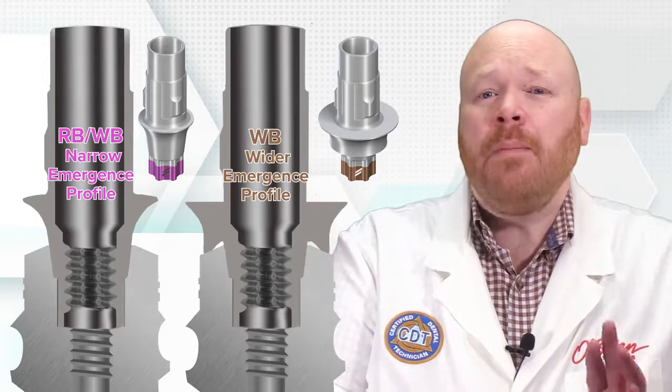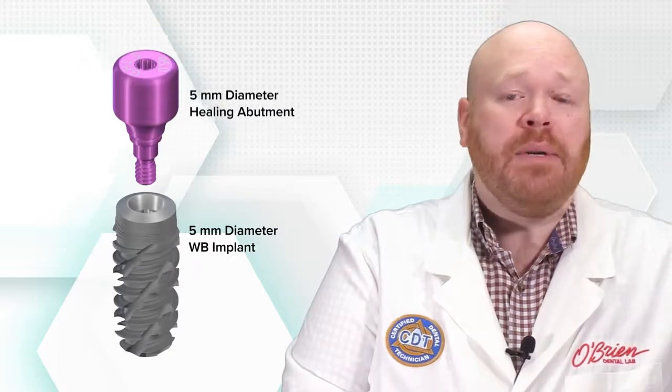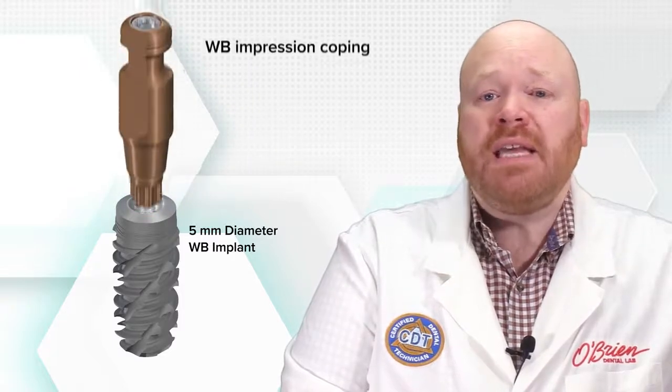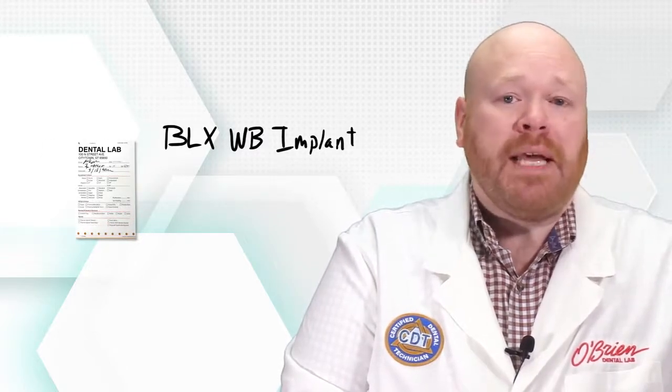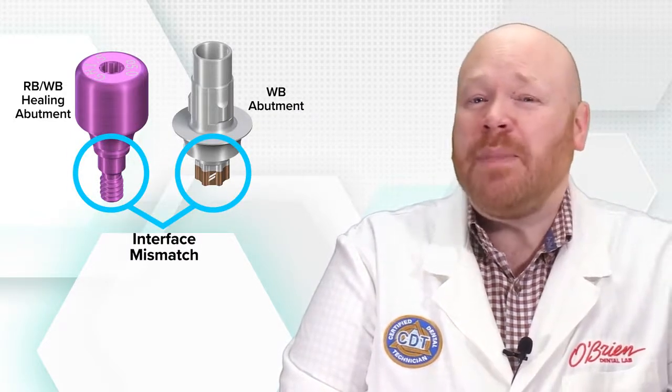It seems simple enough, but here's where it gets slightly complicated. Let's say a 5mm diameter WB implant is placed, and then a 5mm diameter healing abutment is used. So far so good, those are completely compatible. Next, an impression is taken using the WB impression coping and the case is sent to the lab. The RX that's sent with the case also mentions that it's a BLX WB implant. The lab makes the crown using a WB abutment, and then when it comes time for delivery, the abutment won't seat. So what happened? Well, the interface of the WB abutment didn't match the interface of the 5mm healing abutment, which actually is an RBWB.